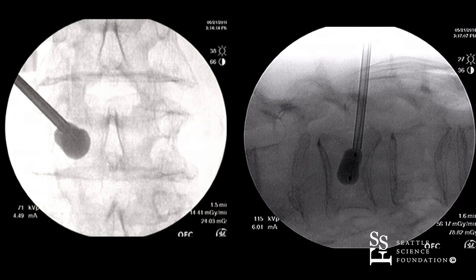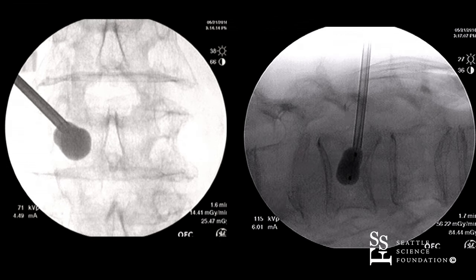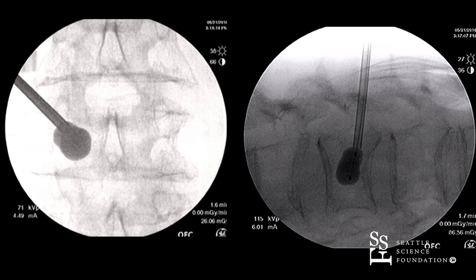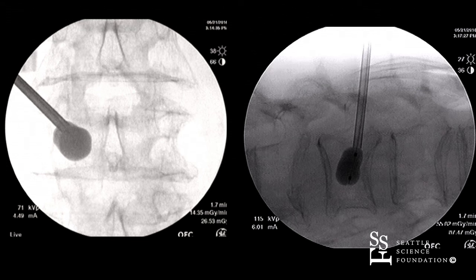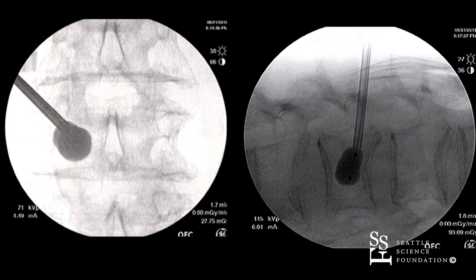As you can see, it's getting close to the left lateral vertebral wall, and right now we're at 160 psi. What's the purpose of the balloon — is it to elevate fractures? Majority of the time it's mainly to create the cavity for the cement to be deposited, though you can get more fracture elevation when it's closer to the actual fracture incident.